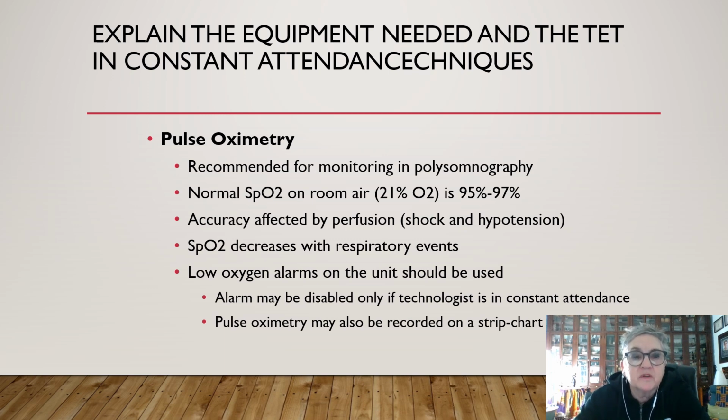Low oxygen alarms on the unit should be used. The alarm may be disabled only if the technologist is in constant attendance. And pulse oximetry may also be recorded on a strip chart.